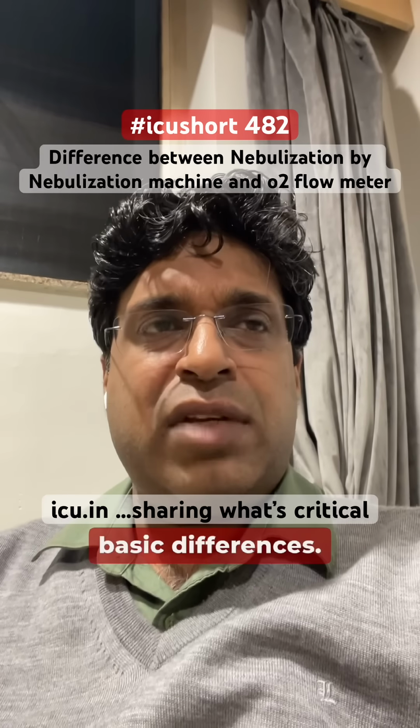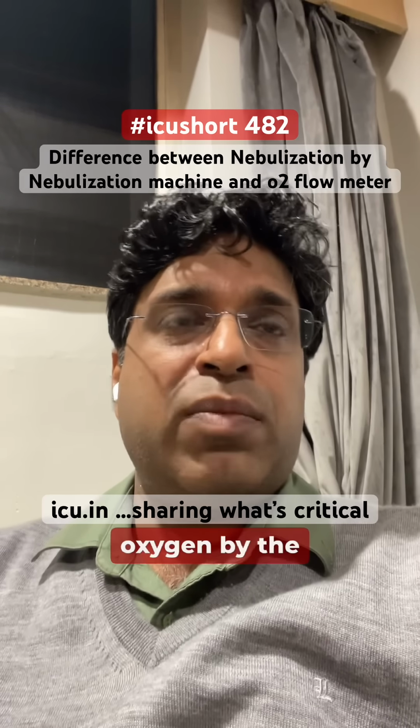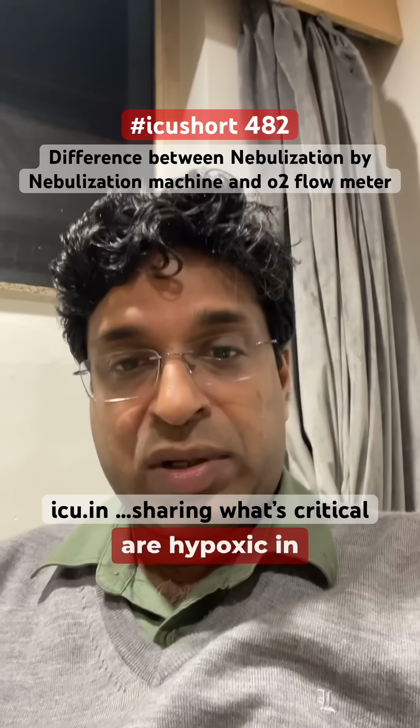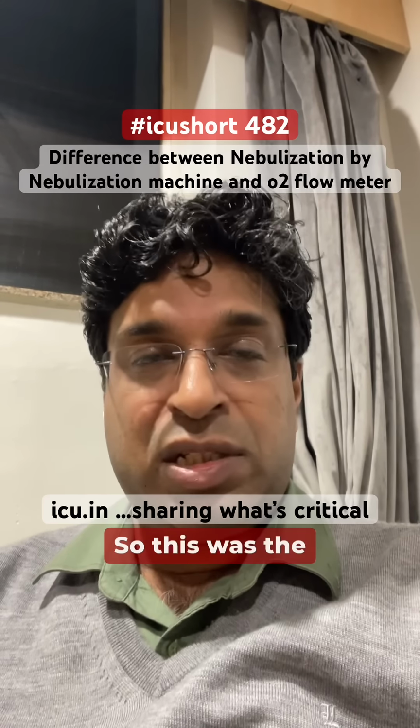So these are the basic differences. Obviously, if we go in the intensive care, the oxygen flow meter is more useful because most of the patients are hypoxic in the ICU. But for a stable patient, you can use the nebulization machine. So this was the answer.